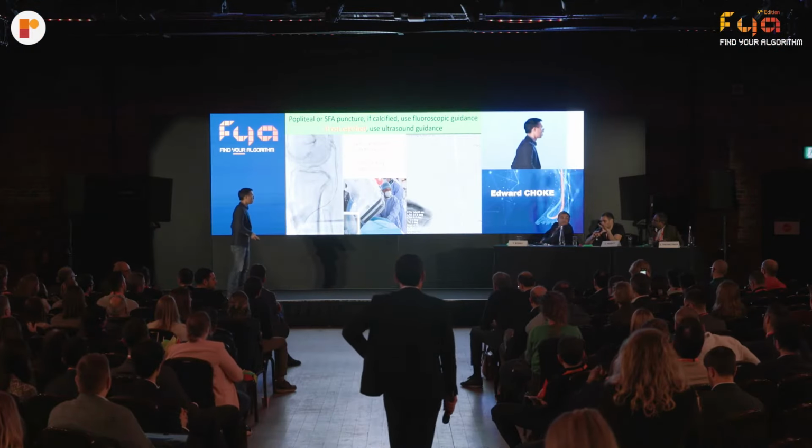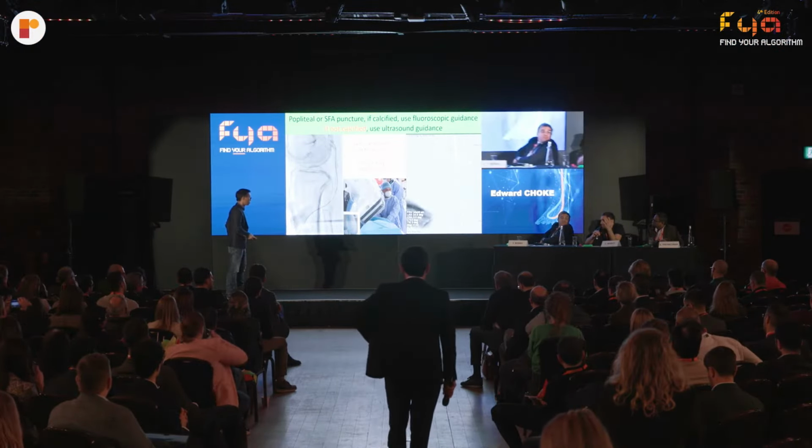Can I just ask a quick question on the panel? We're seeing a lot of angio images with fingers in the screen, and the way I was trained, it was a forbidden technique. But I cannot deny watching you do it. It looks very easy. So I don't mean a show of hands or flags, but is this something other people are doing?